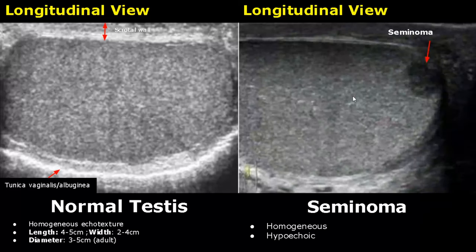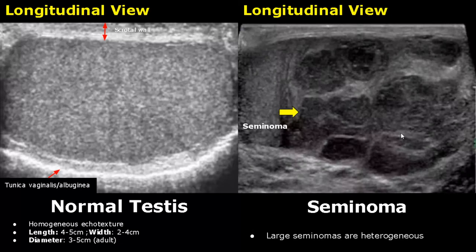A seminoma is a type of germ cell tumor. Usually it appears as a homogeneous hypoechoic mass. If the mass is large it can appear heterogeneous.